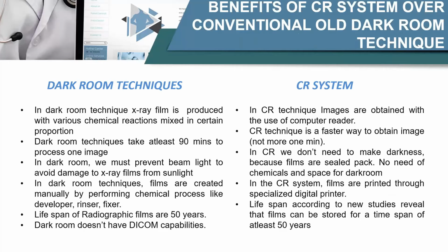So I will compare now CR system with the previously used darkroom techniques. At start, we used to work in darkroom. So in darkroom, there are hassles actually to get the images, which are like we have to use many chemicals in a certain proportion for developing an image.